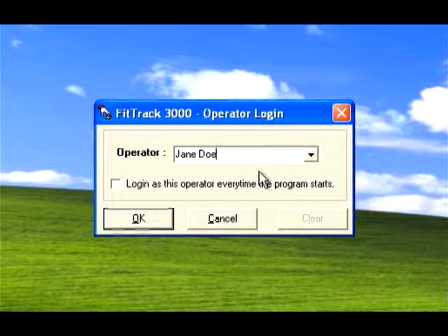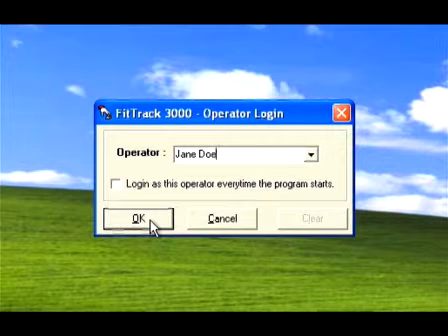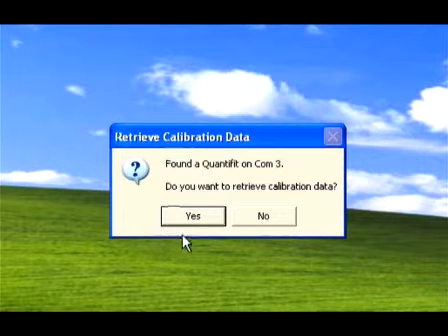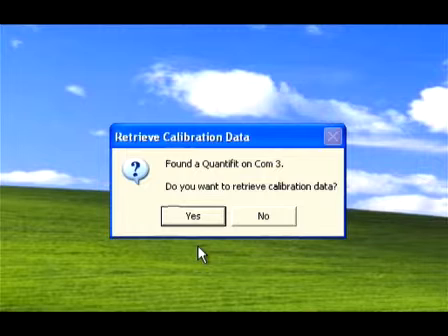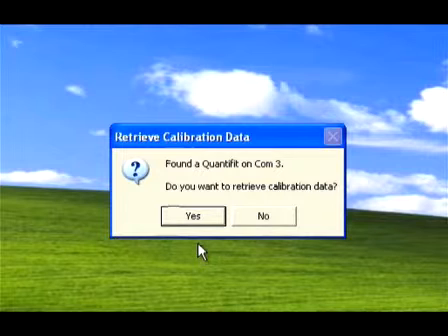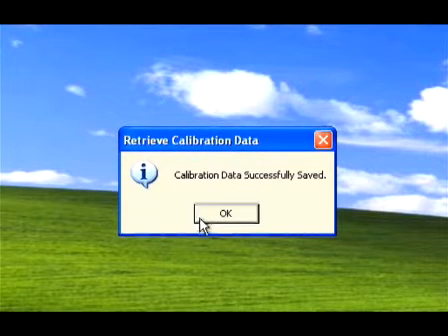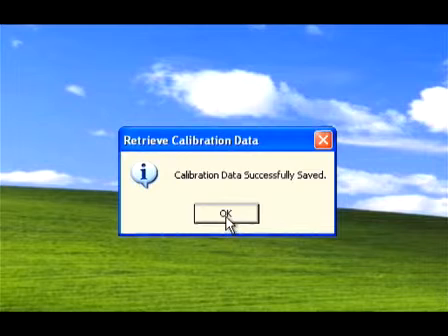A window will pop up to confirm that the software found a Quantifit connected to the computer. You will then be asked if you want to retrieve the calibration data. Click yes if you would like to store the calibration information in your database, or no to bypass this option.